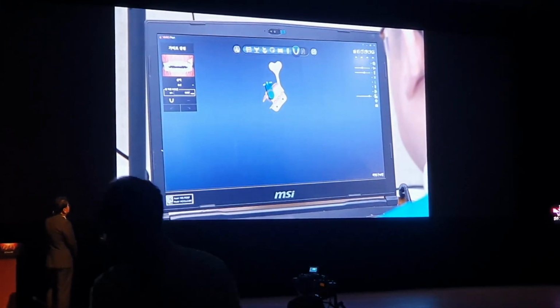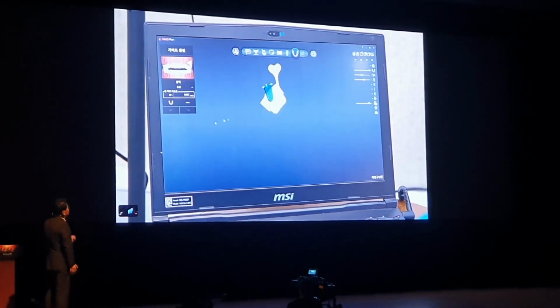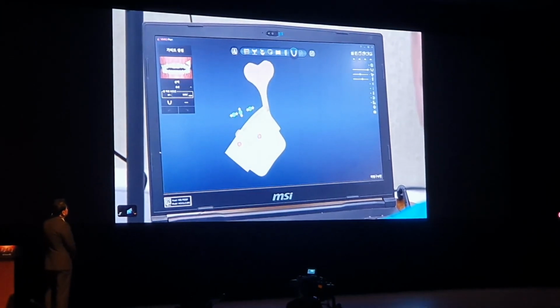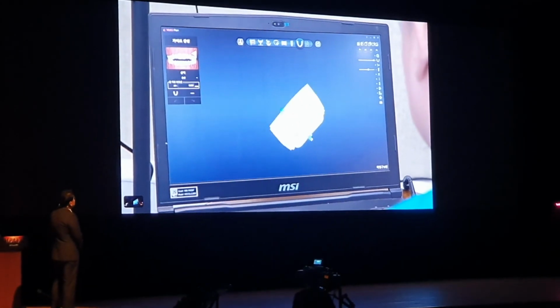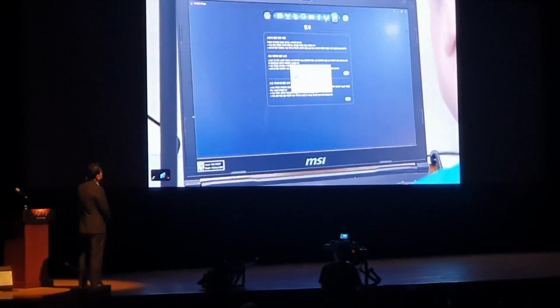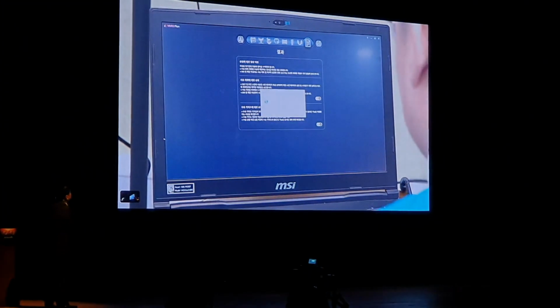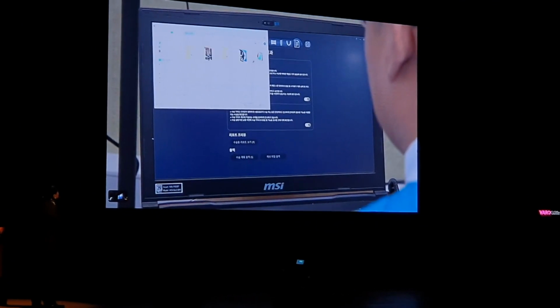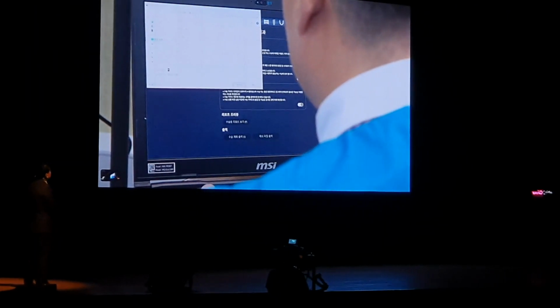So planning toward the front like that will allow direction to be more visible. Let's make a 12 mm offset. So after finishing planning, the file will be transferred to a distinct file, the NC file, which works for the milling machine. Once the file becomes the NC file, the data will be sent to the milling machine, and then once data is delivered, milling becomes ready to act.